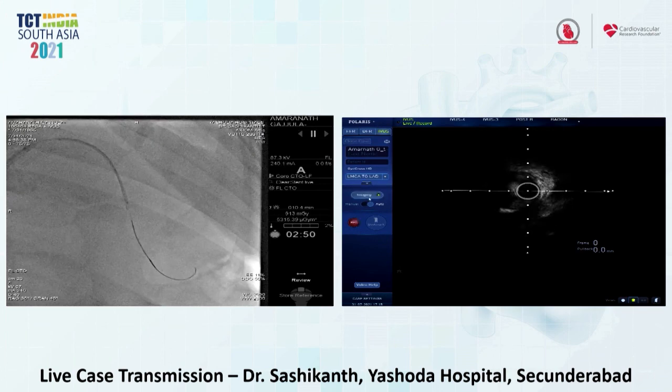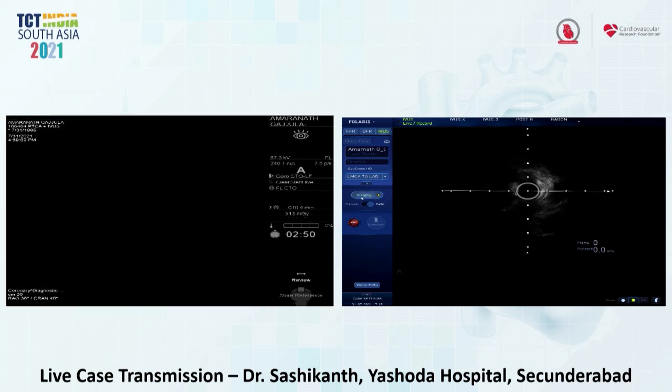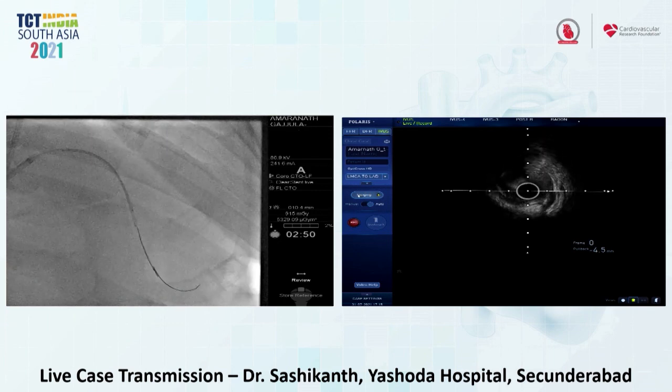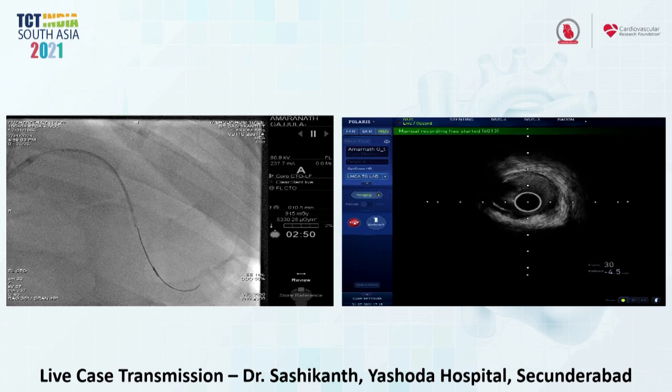This will be, from my perspective, also enough. And to see how is distal diameter, not to overstretch the vessel, not to risk distal dissection. Yeah. So the IVUS catheter is now distal to the stent, distal marker of the stent, and here you see the healthy vessel there. Now we know we are landing the stent in the healthy segment there. It's almost a 3 millimeter vessel there.